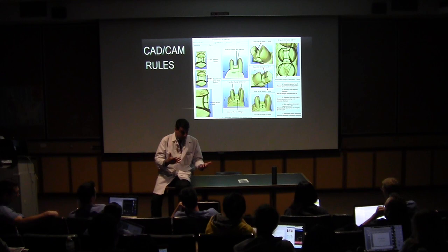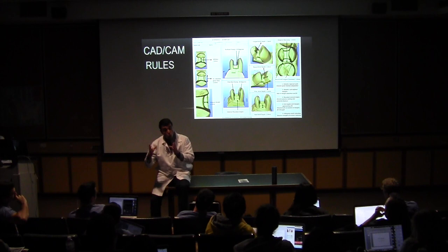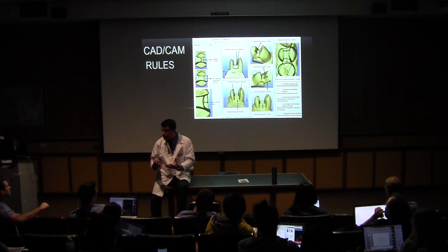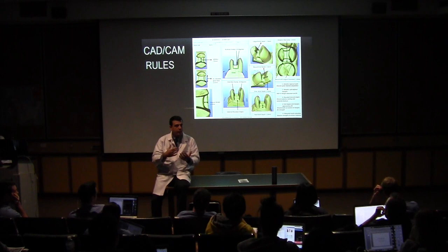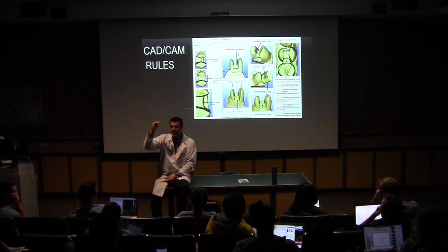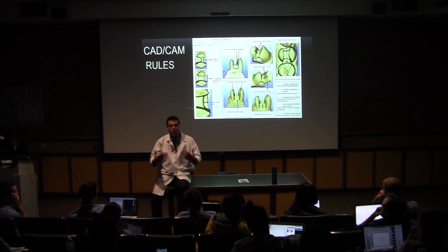Keep in mind that because here we are cutting plastic teeth, the same rules won't apply in the clinic. In the clinic, you will find a tooth compromised by a large restoration done before, or a large decay because the patient didn't brush or floss properly, or an accident, like a punch in the face, that broke the tooth. But still, it is important for you to memorize every single rule I just gave you. For instance, what is the main rule for inlays and onlays? What is the number one rule when you're prepping a tooth to receive an indirect restoration?